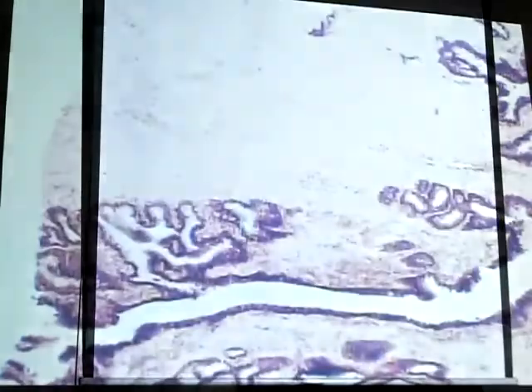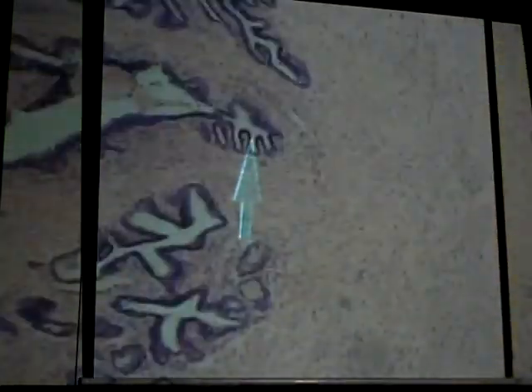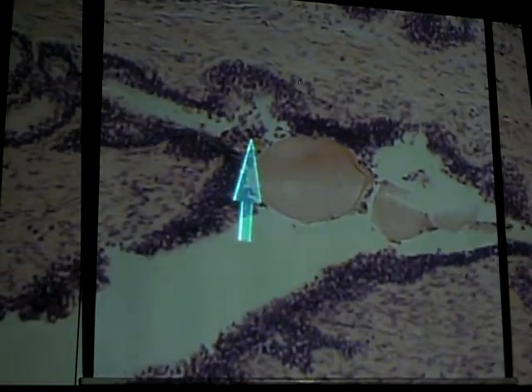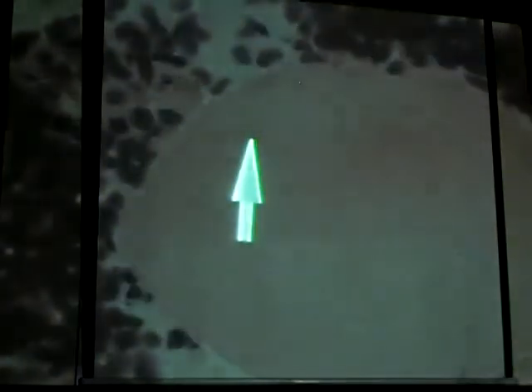In the older prostate, we have these concretions that are formed. Here are some. These are prostatic concretions, which are characteristic of the prostate. If you see that, that can help you to identify the prostate. These are just formed over time. They develop, and as the person gets older and older, you have more and more of these forming.